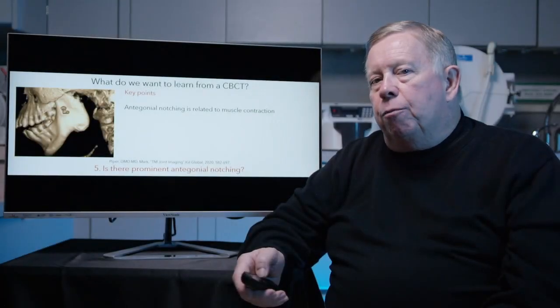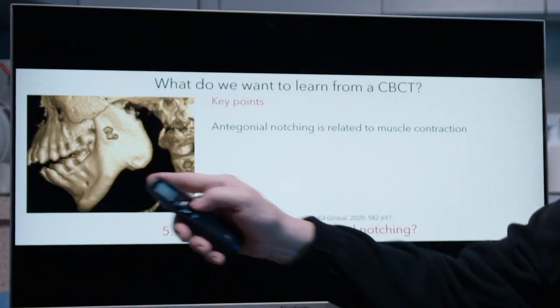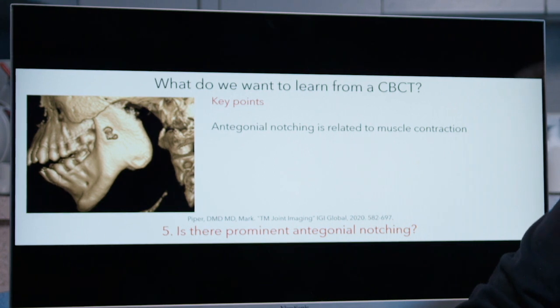The fifth thing we're going to look at is to look for prominent antegonial notching. When you look at that, I'm thinking about that in terms of muscle contraction.